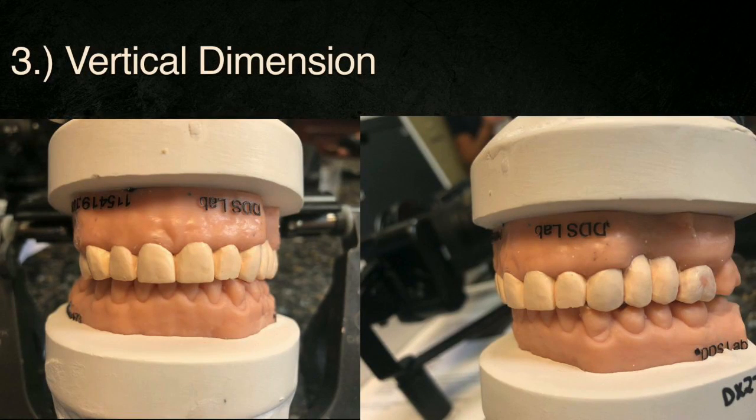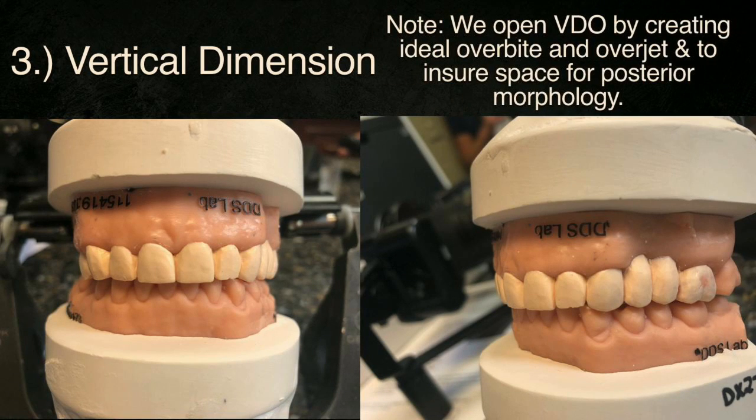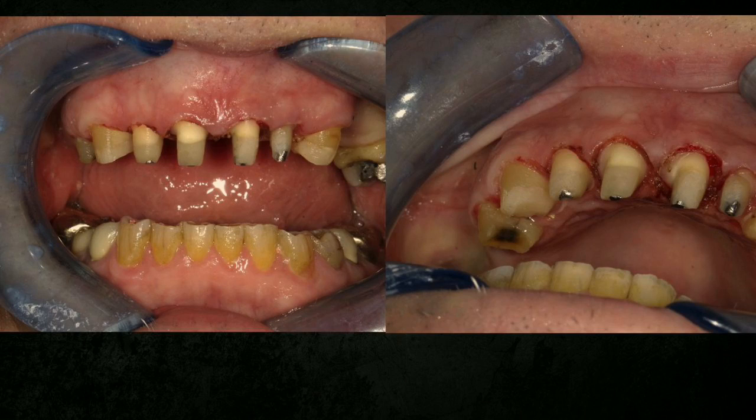And at this point, we're basically going to open the vertical dimension until we can visualize a good overbite-overjet relationship in the anterior. Podnosimy sobie na tyle wymiar pionowy zwarcia, żeby uzyskać dobrą relację zarówno w wymiarze poziomym, jak i pionowym i mieć estetyczny odcinek przedni. All right, and this also allows us to make sure we have enough space in the back for posterior morphology. A więc odtwarzając idealny nagryz poziomy i pionowy, stwierdziliśmy, że możemy uzyskać dobrą ilość miejsca do odbudowy zarówno w odcinku przednim, jak i bocznym.